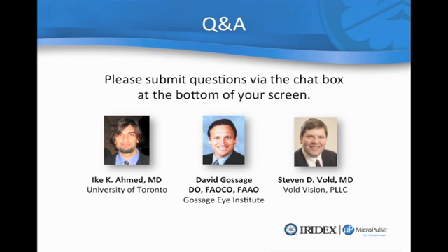The only thing I would not do, though, is I wouldn't really perform on patients with neovascular glaucoma who have peripheral anterior synechiae. Those patients obviously don't perform well with the laser treatment itself. The ease of getting used to it is a matter of just performing a procedure that's very similar to doing an SLT or an ALT.